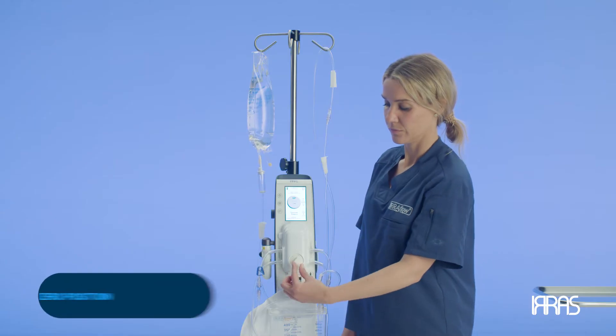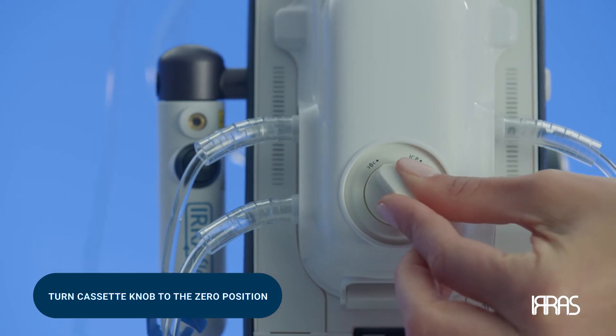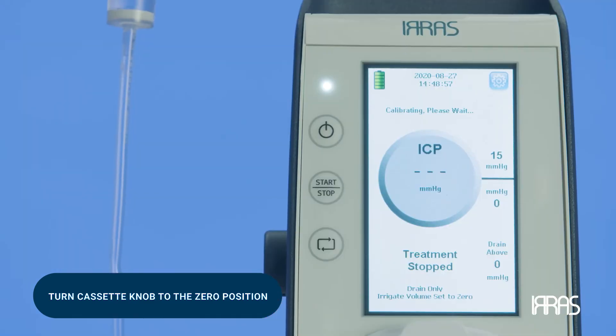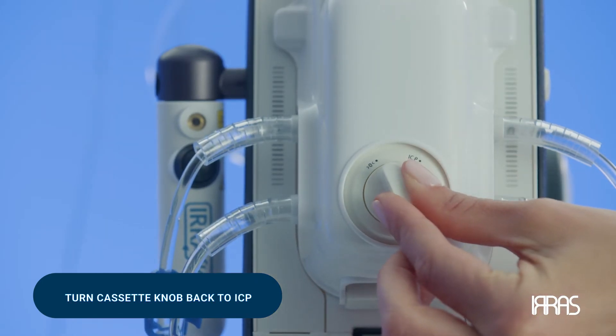To accomplish this, turn the cassette knob to the zero position, delineated by the zero icon, and wait for the control unit to calibrate. When calibration is complete, turn the cassette knob back to the starting position, which is labeled as ICP.